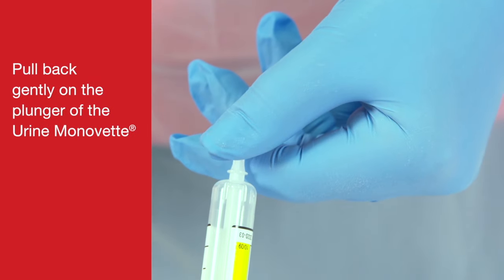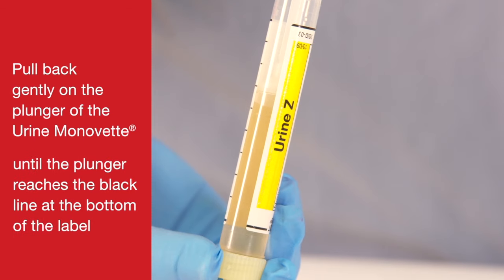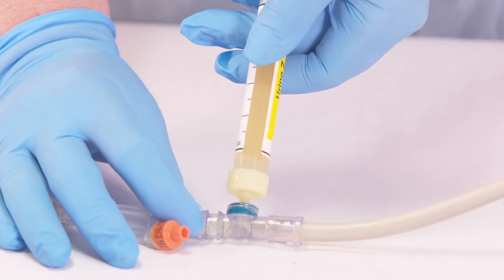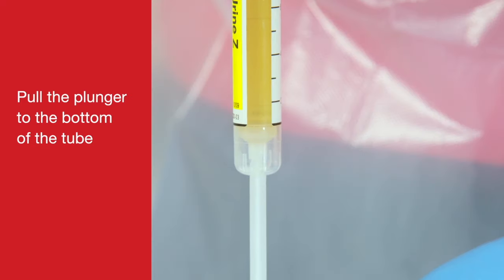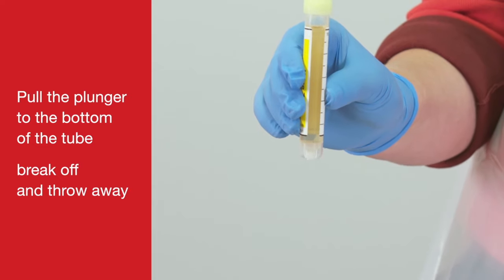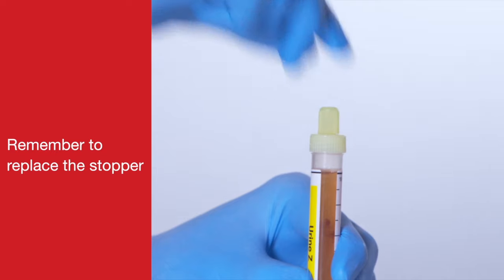Pull back gently on the plunger of the Urine Monovette until the plunger reaches the black line at the bottom of the label. Pull the plunger to the bottom of the tube. Break off and throw away. Remember to replace the stopper.